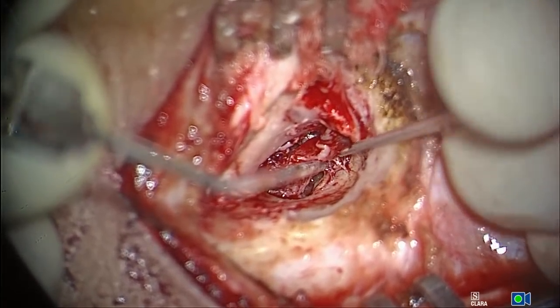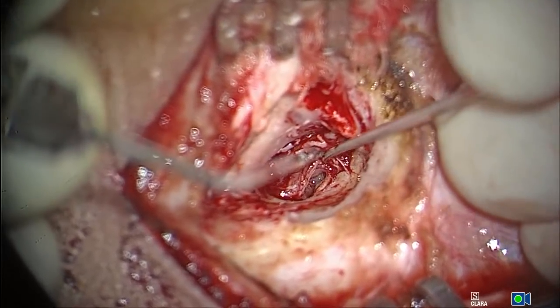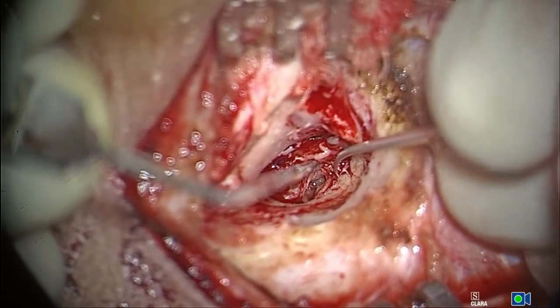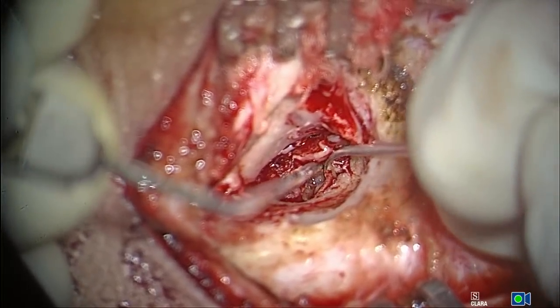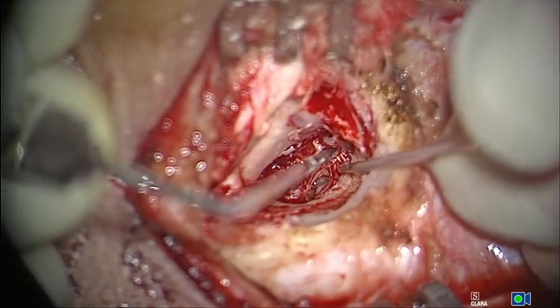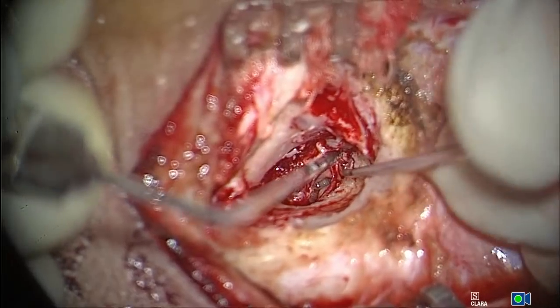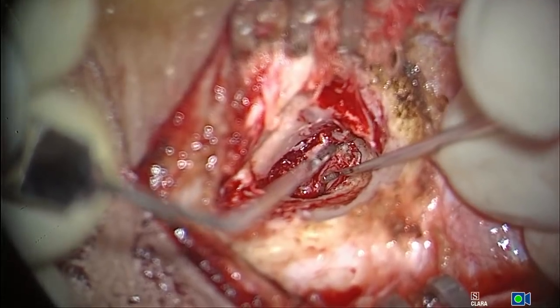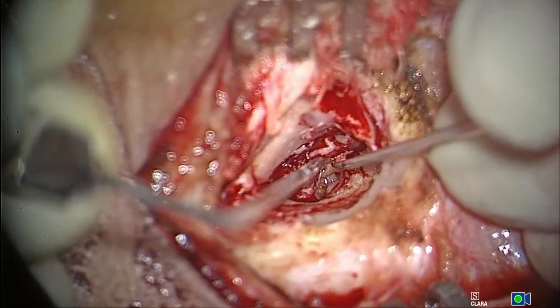I always say, even in the brain, when I do skull base, it's micro dissection. So we need two hands. Some people say that in FESS you usually only have one hand, so why not use it in the ear? No, in FESS you have a debrider. The debrider gives you three functions: suction, cutting, as well as it sucks and irrigates. Whereas that sort of instrument is still not there in endoscopic ear surgery. Until then, I think this is not the ideal way to perform ear surgery.